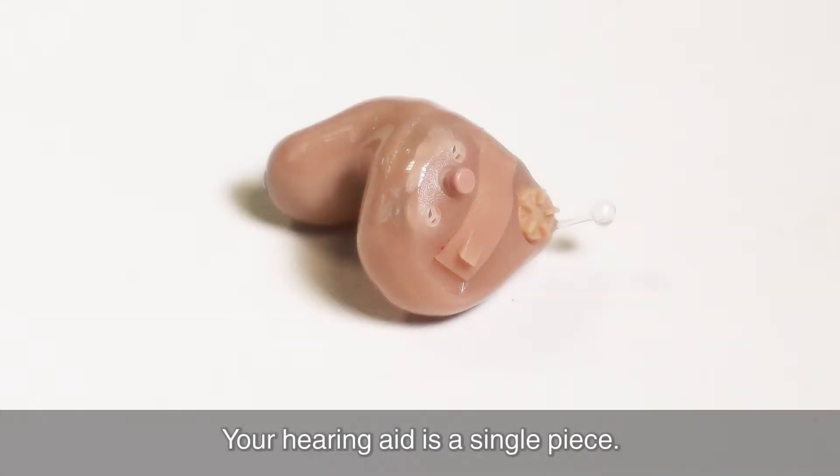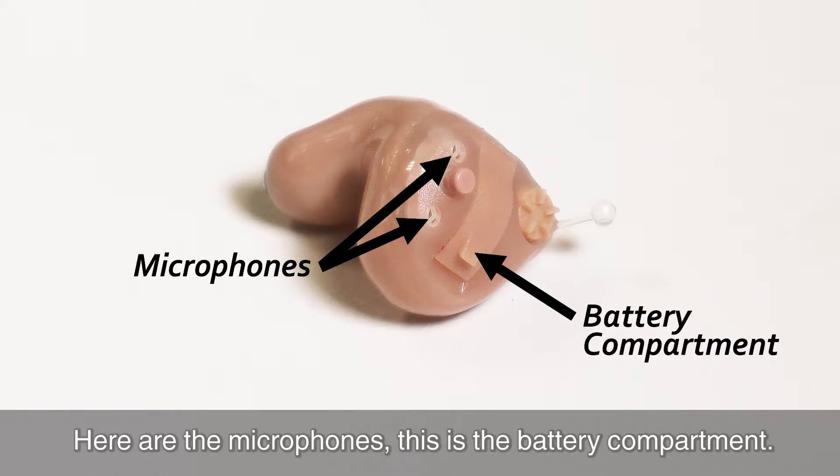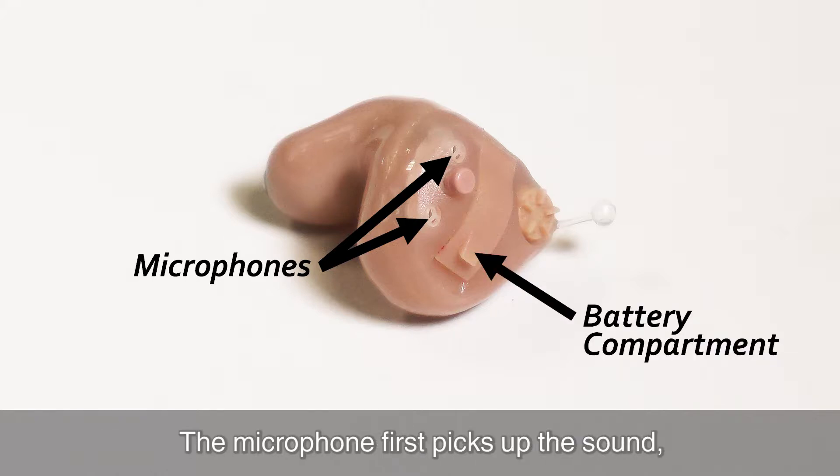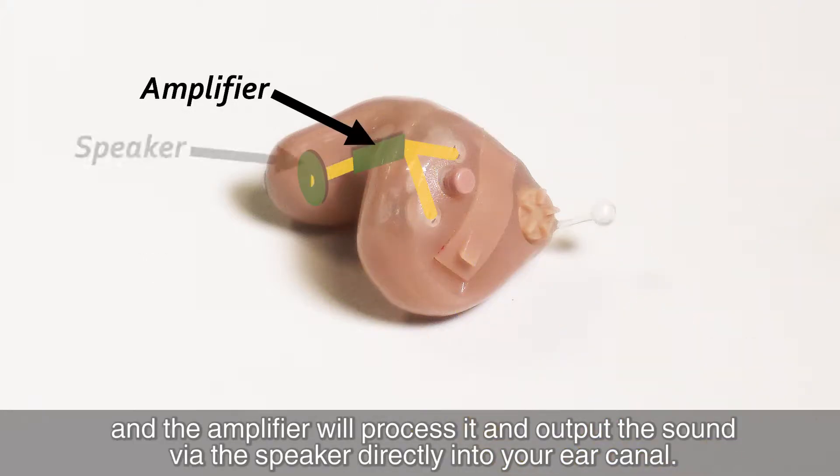Your hearing aid is a single piece. Here are the microphone. This is the battery compartment. The microphone first picks up the sound and the amplifier will process it and output the sound via the speaker directly into your ear canal.